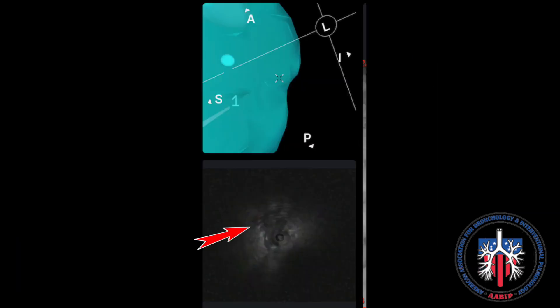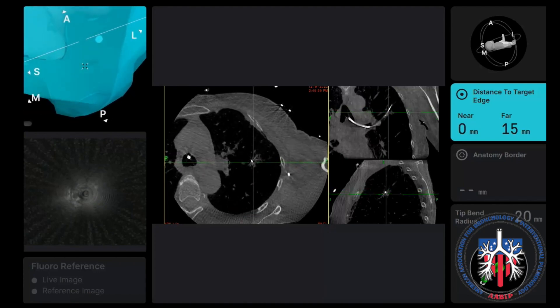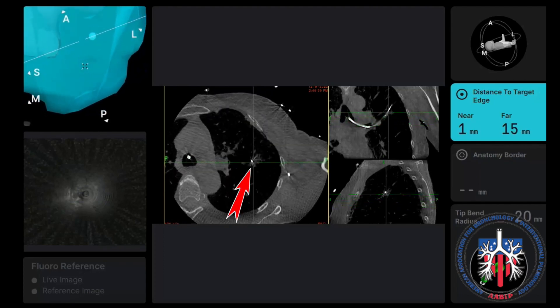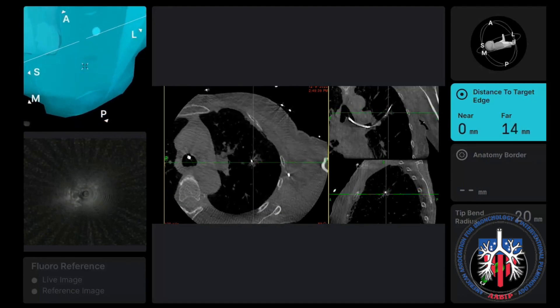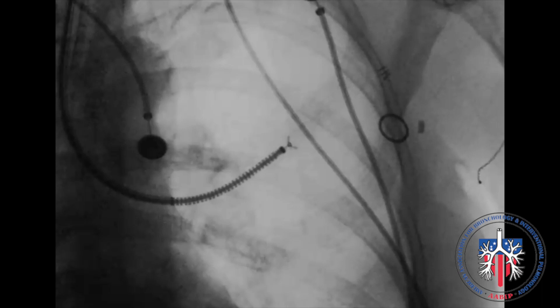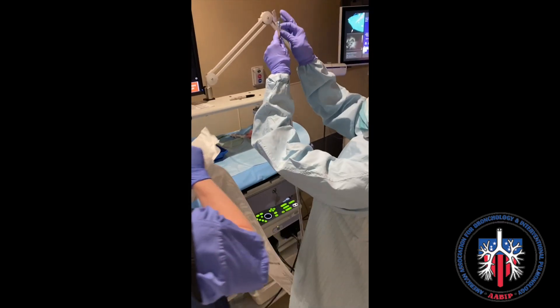When the target was identified, there was a signal with the radial EBUS confirming the target. Cone beam was also performed, confirming tool and target on all CT scan cuts. When confirmed, the catheter was adjusted to be more concentric, biopsy was performed, and rapid on-site evaluation in the room confirmed malignancy.